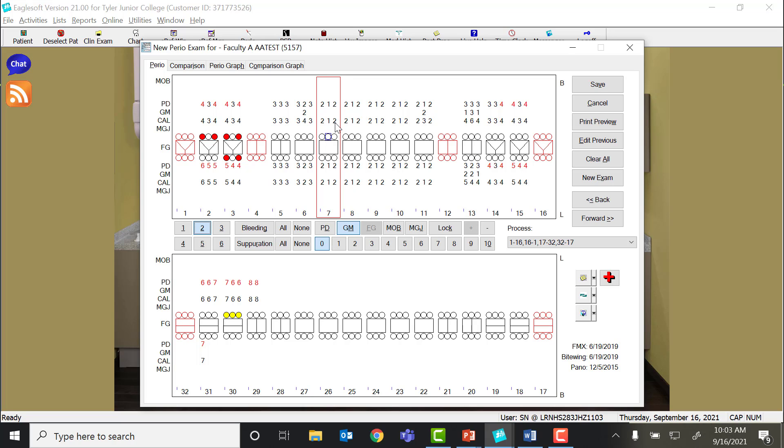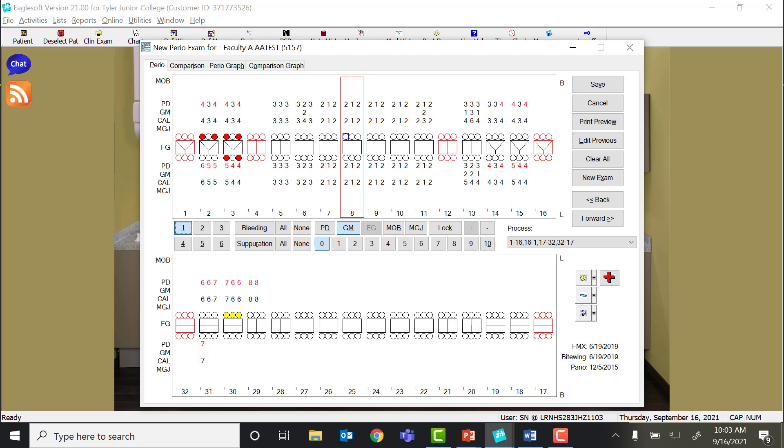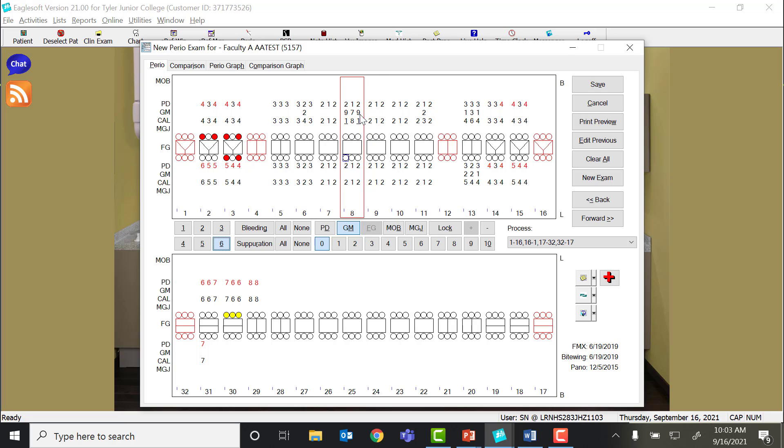We do not make you go in and subtract when there is inflammation unless it is pretty severe. But if a patient has gingival enlargement, say due to a medication, and you are getting really high readings, we can do here on the facial. We've got 9, 7, 9. We'll look at just one tooth here. And then maybe the lingual is fine.